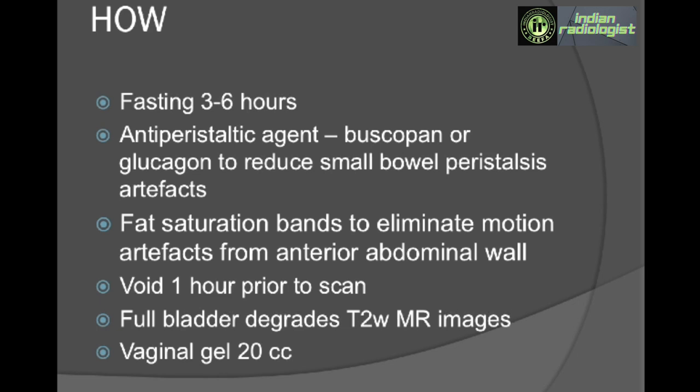Patients should empty the bladder about an hour before the scan. Now, if the bladder is too full, it degrades the T2 weighted images by producing artifacts. Whereas if the bladder is very empty, you're going to have a limitation that sometimes there is involvement of the bladder in pelvic pathologies, and you'll not be able to assess that.